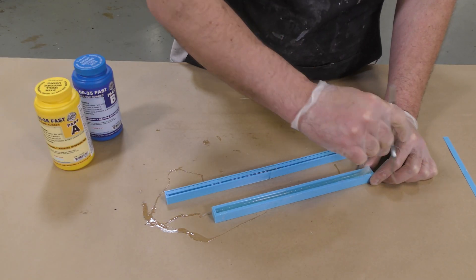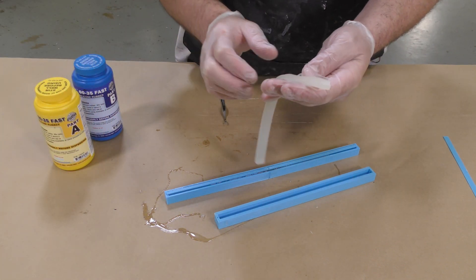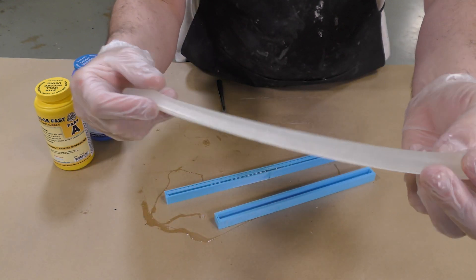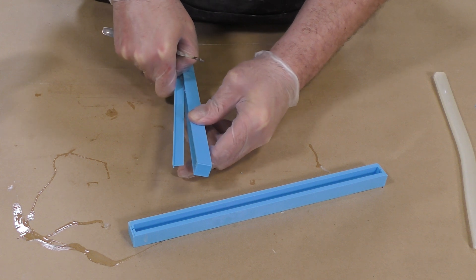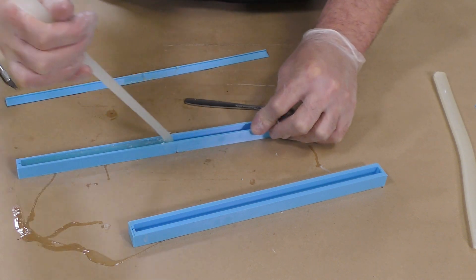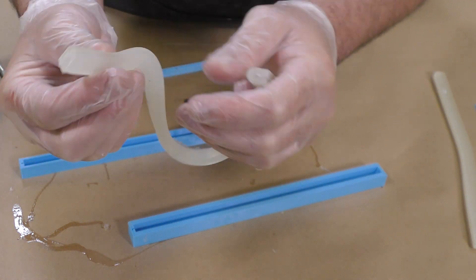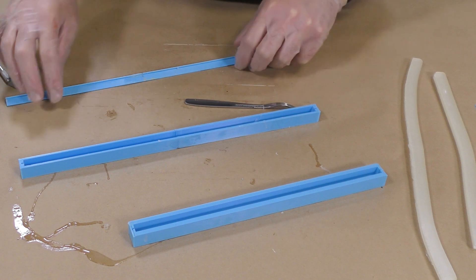Now that our silicone has set up — five minutes — we can de-mold those channels. Here I just want to show you what that looks like: you can spread them open in a V shape. You can print these in any kind of lengths. If you want to make one continuous channel, you can do that, or you can make several small ones sized for each individual mask — that's up to you as far as how you want to handle the making of those channels.